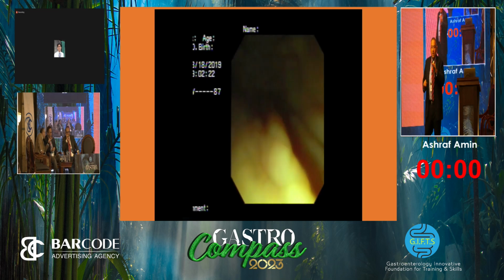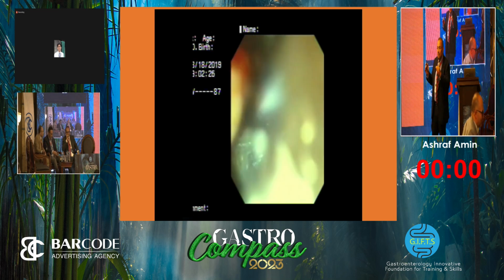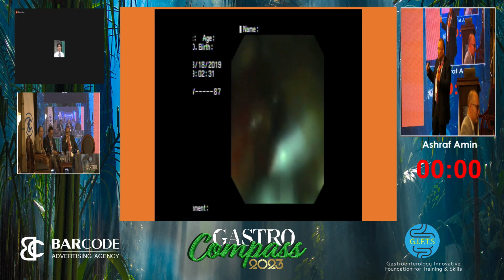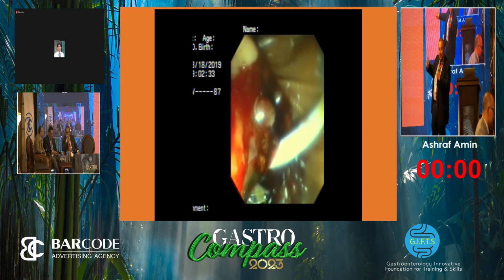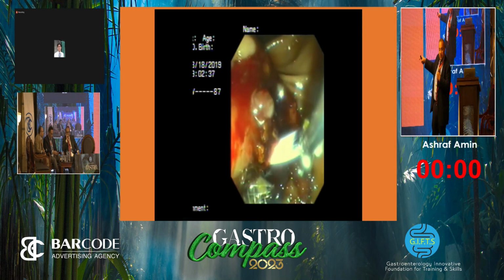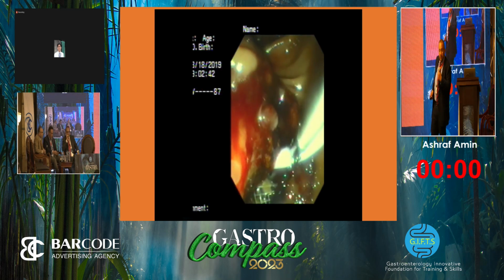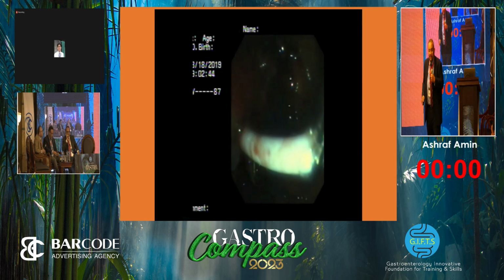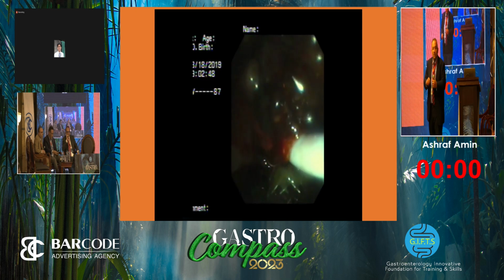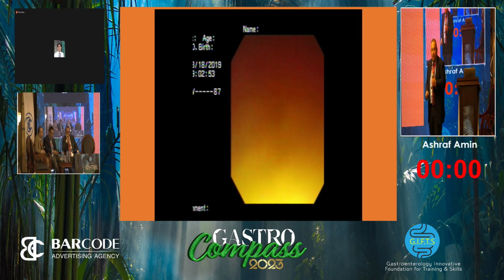By this technique, you can use the guide wire for ERCP to cut anything. If the gastric band invaded the stomach, you can put the guide wire and cut it with the Soehendra technique. Sometimes, if you're doing many ERCPs, you can see this metallic stent migrated, very common, especially if it is done with an intervention radiologist. It's very cheap. You take the wire, you put it in the catheter, and you crush it like a stone.